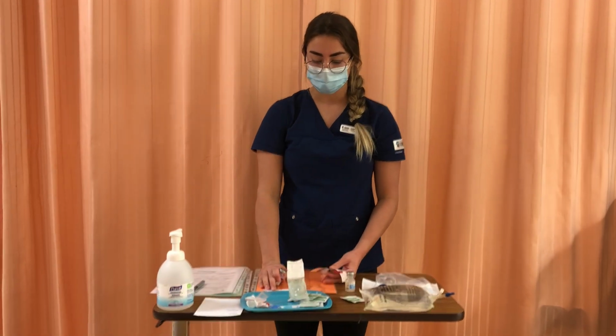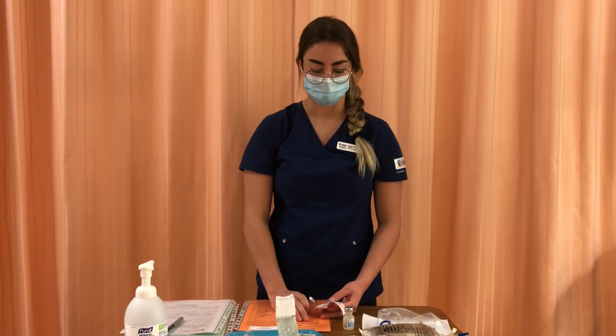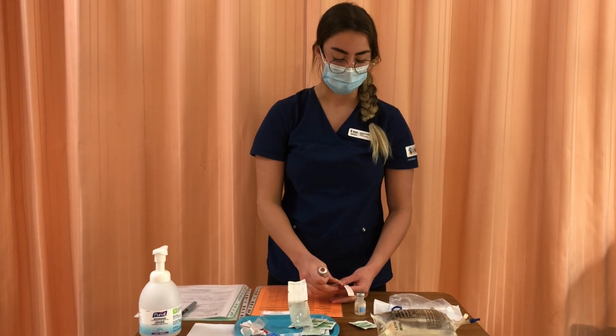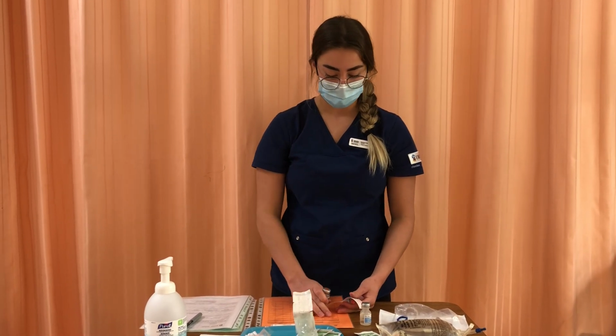So we have right patient, Benicio Vines, right medication, Azithromycin, right dose, 400 milligrams. This is a 500 milligram vial. So for 400 milligrams, I'm going to need 4 milliliters, which is what I have here. Right route, IV. This is an IV medication.